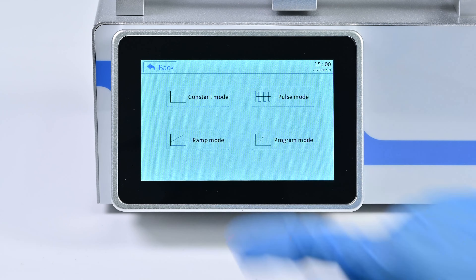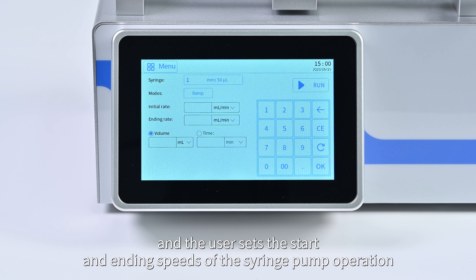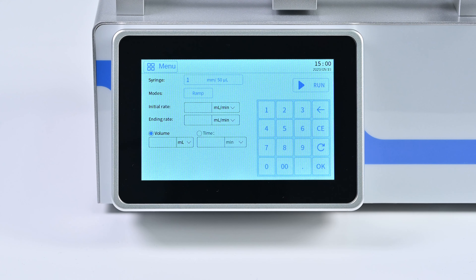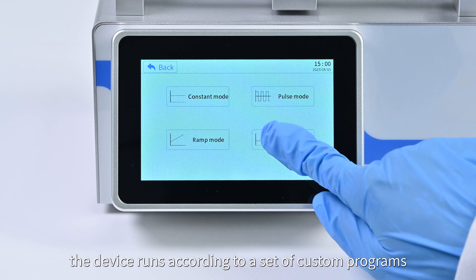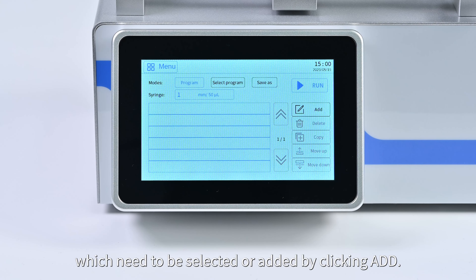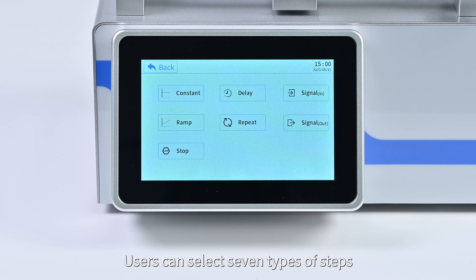In ramp mode, the device continuously accelerates infusion at a constant acceleration, and the user sets the start and end speeds of the syringe pump operation. In program mode, the device runs according to a set of custom programs. Users can add steps by clicking 'Add', and select from seven step types: constant, ramp, repeat, delay, signal in, signal out, and stop.